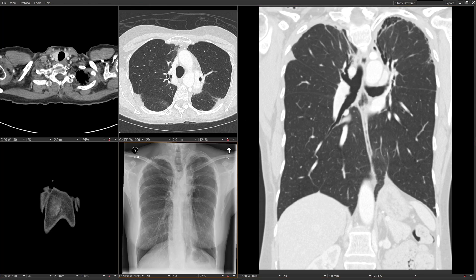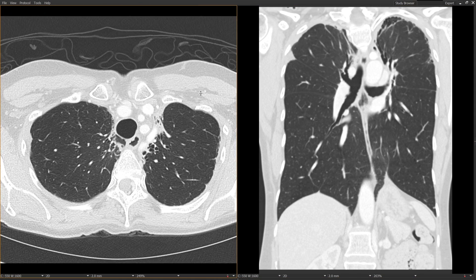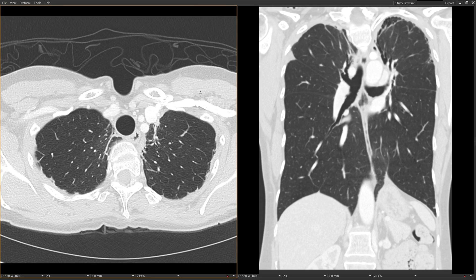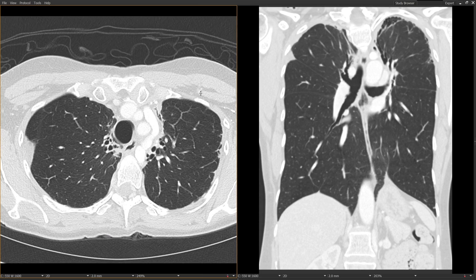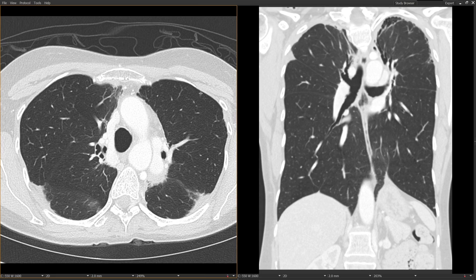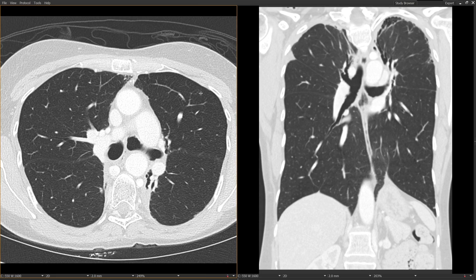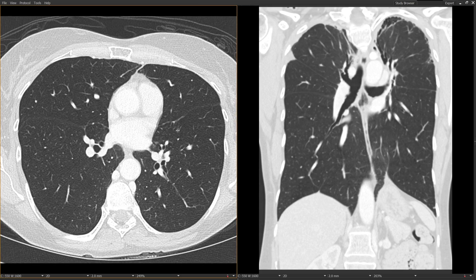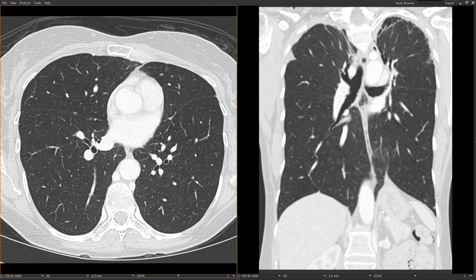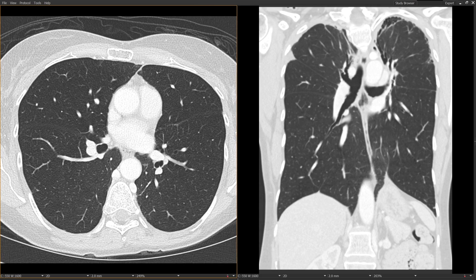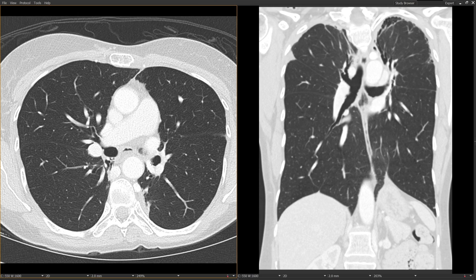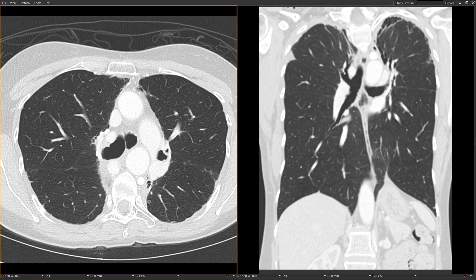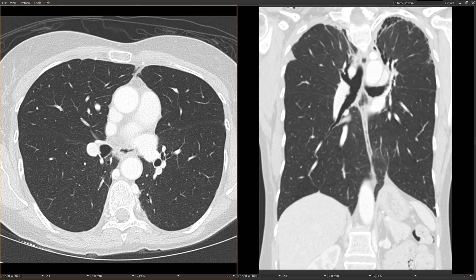The axial images show the same findings: reticulation, traction bronchiectasis — which is a hallmark of radiation fibrosis — and obscuration of the mediastinal contours. In this patient with mantle field radiation, the radiation field goes down quite far, almost to the level of the inferior pulmonary veins. You can see there's a little bit of radiation fibrosis in the perimediastinal portions of the lower lobes as well.